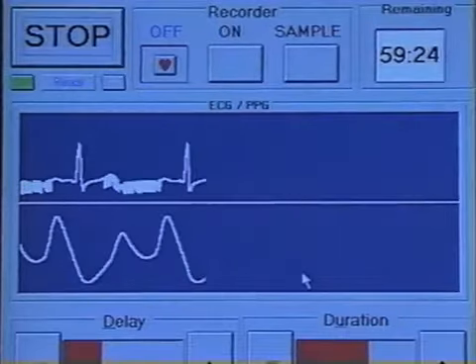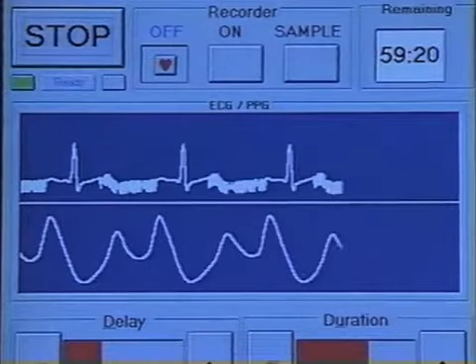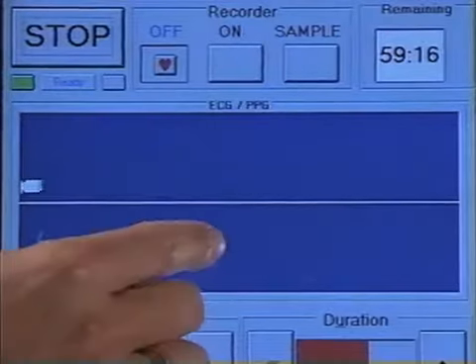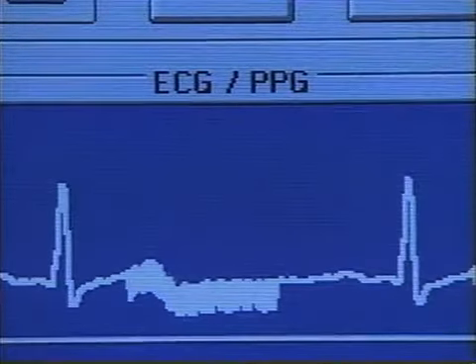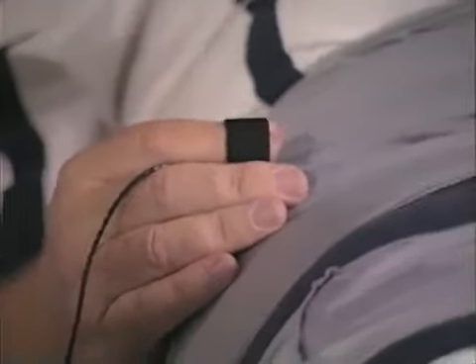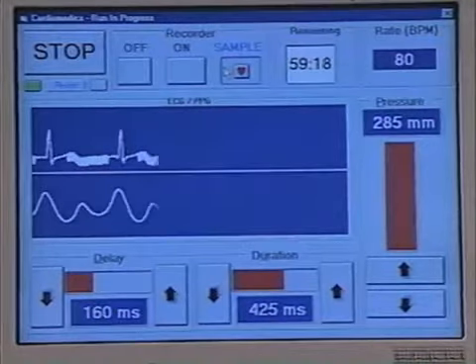The patient's electrocardiogram is also displayed on the CardiAssist control panel. The wavy line on the ECG indicates the point of application and cessation of pressure being applied. Both ECG and pressure tracing can be frozen at any time for a closer inspection of detail. Arterial pressure is obtained from a finger plethysmograph and is also displayed on the CardiAssist control panel.